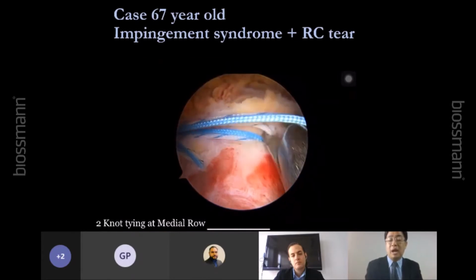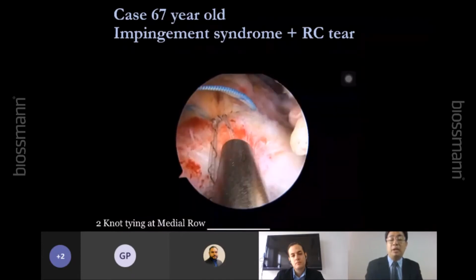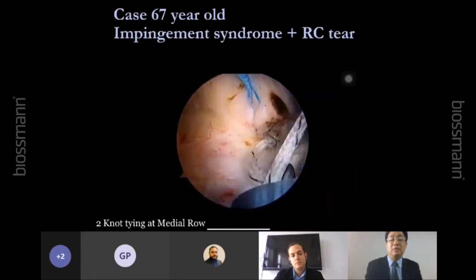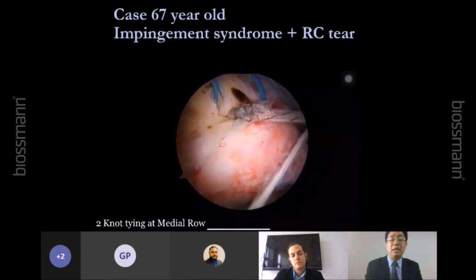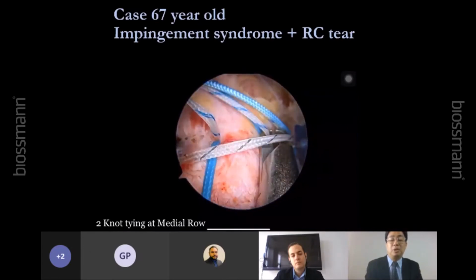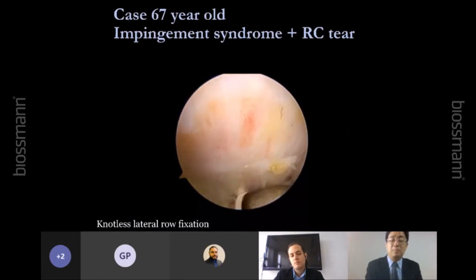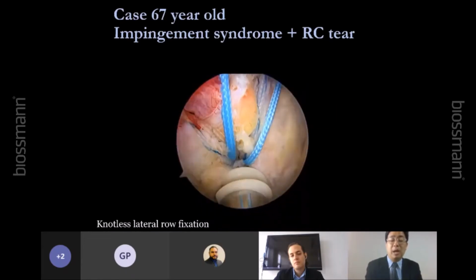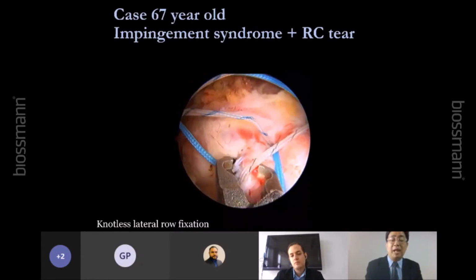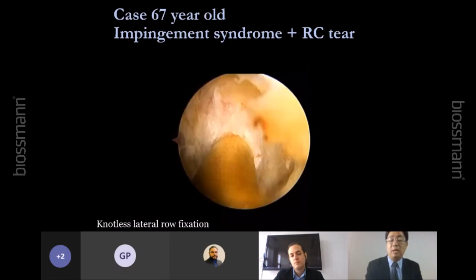And after that, I just do limited knot tying, okay? For this patient, 1 in the front, okay? And 1 in the back, okay? I prefer to tie the black tiger, okay? And then we do the suture bridge. So this surgery takes only 40 minutes, okay? It's very fast because you just make 4 holes and then you just tie 2 knots and make a suture bridge, okay? So for the lateral row, 1 hole, I will put 6 sutures in one hole. Okay, like that.